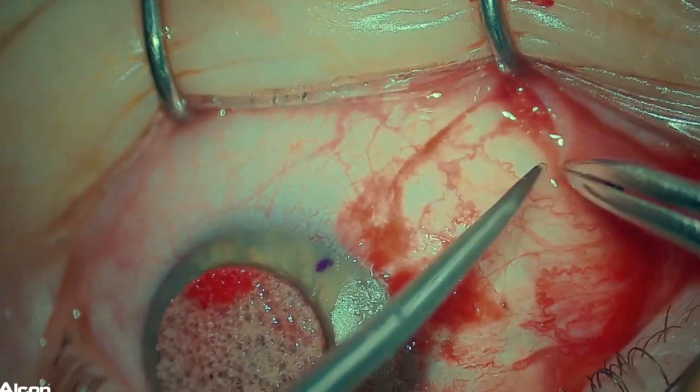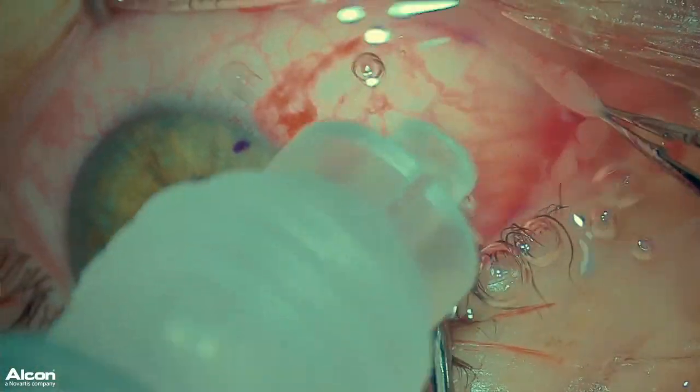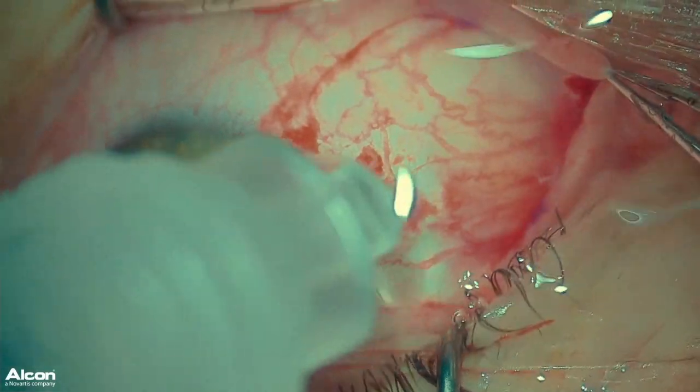I then apply sponges soaked with mitomycin C under the conjunctival edge, and then irrigate extremely well with balanced salt solution.